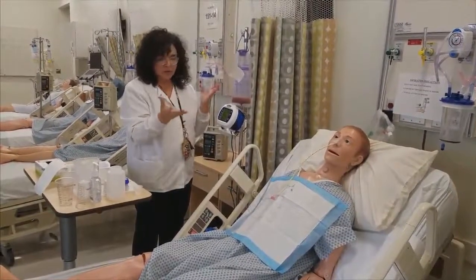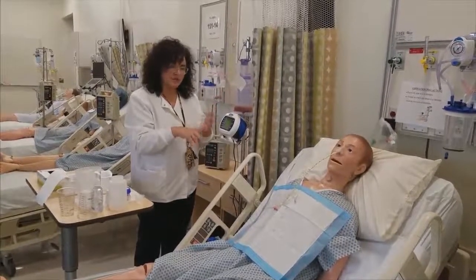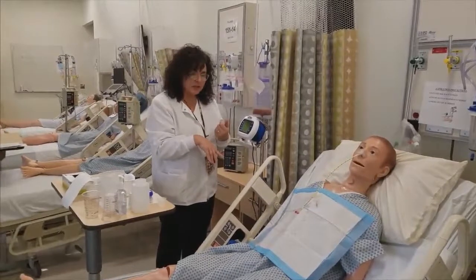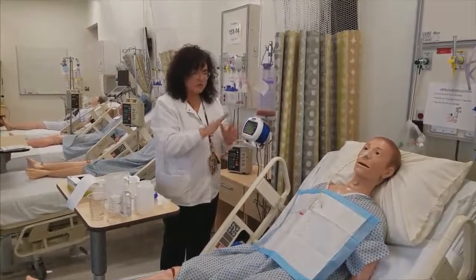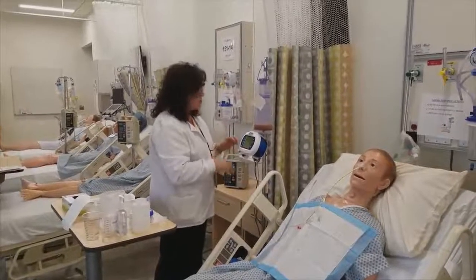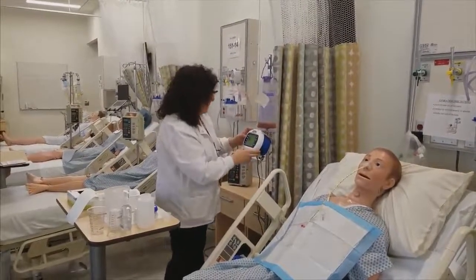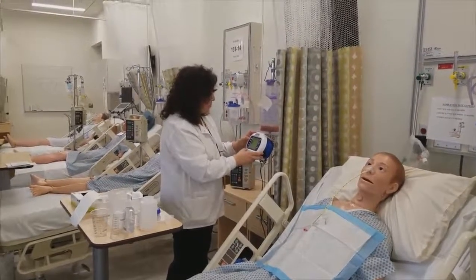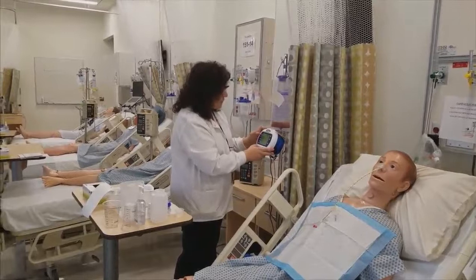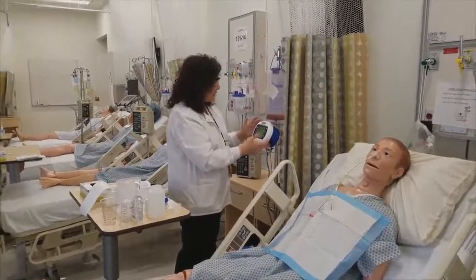Think about all of the parameters for tube feeding tolerance: abdominal distension, nausea, vomiting, liquid stools greater than 3 in a 24-hour period, changes in bowel sounds, so I'm looking for all of those things. Along with my GRV, all is well. I would add more tube feeding as needed, and then I would go ahead and bump up my rate to 50, because remember, we're going up incrementally as tolerated.